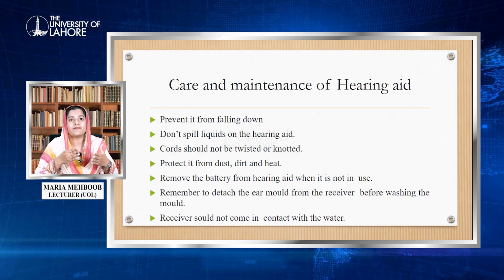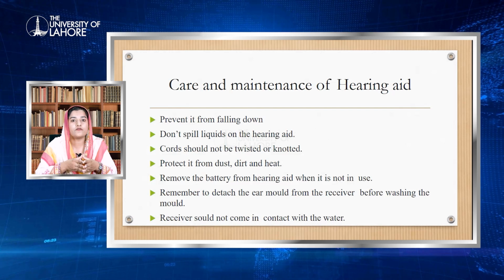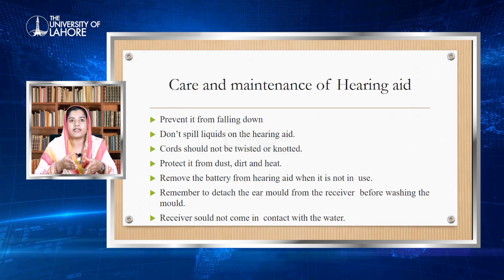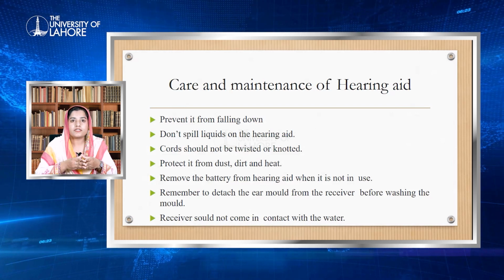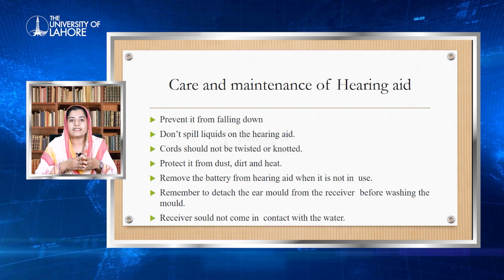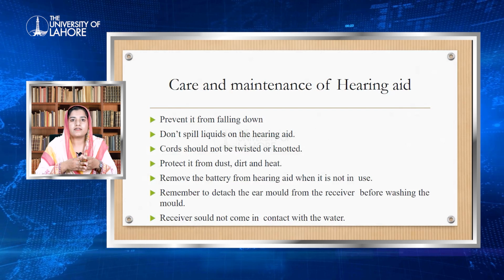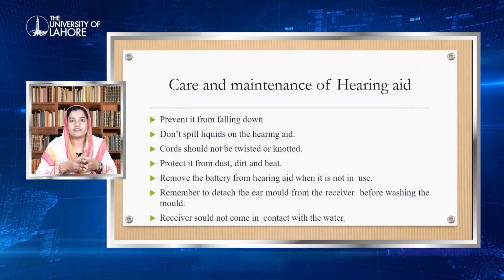How we can maintain a hearing aid is an important topic for the audiologist, because an audiologist has to counsel the patient about the maintenance of the hearing aid, and it is also important for the patient to know how to do maintenance of the hearing aid. First of all, prevent it from falling down. Don't spill liquid on the hearing aid, because hearing aids are not waterproof. Protect it from dust, dirt and heat. Remove the battery from the hearing aid when it is not in use.